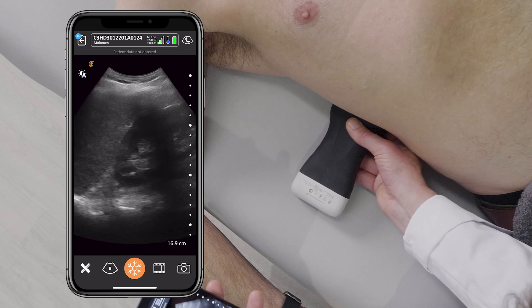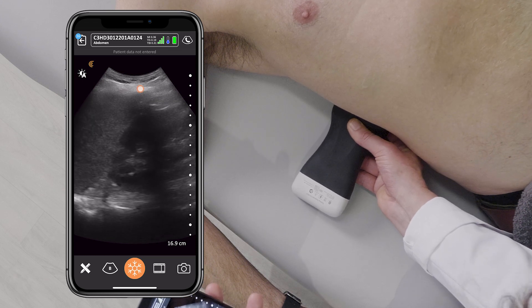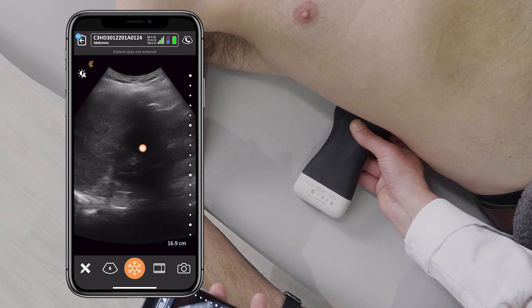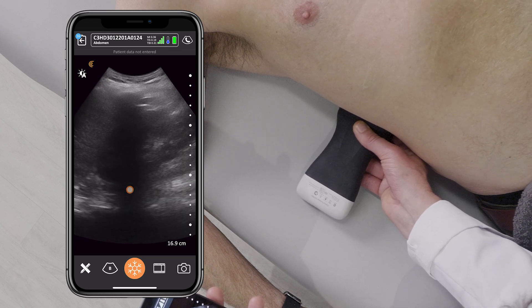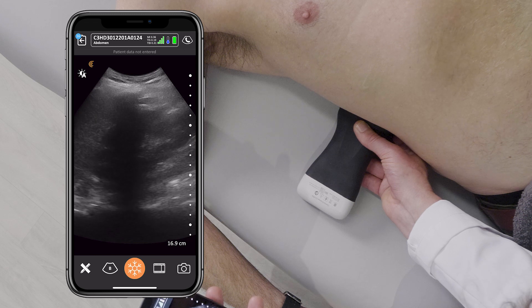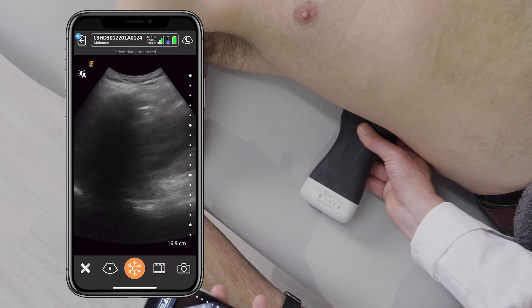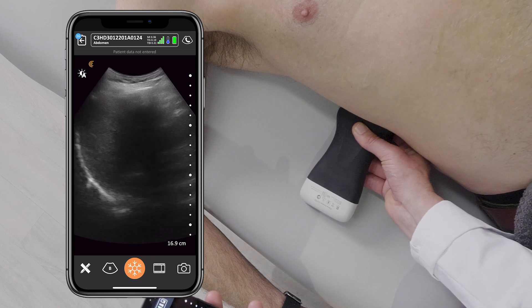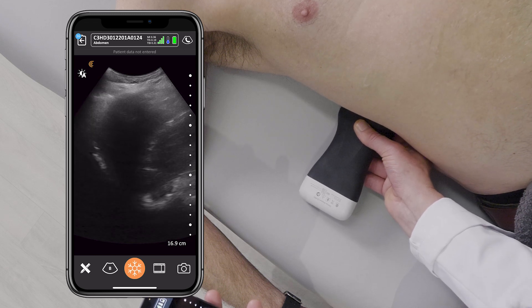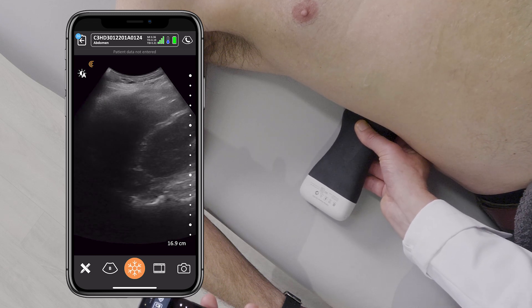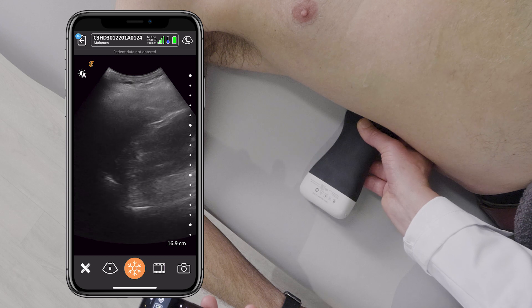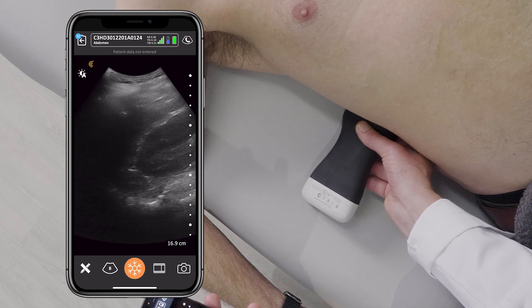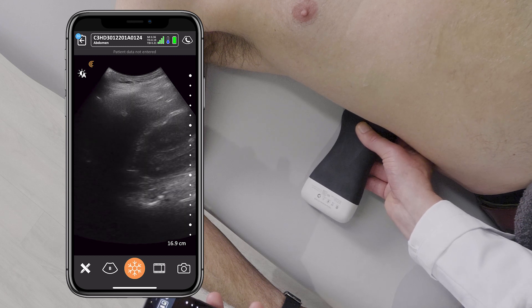If I'm having trouble seeing the kidney because of a rib shadow, I can ask the patient to take a small breath, and this can bring the kidney right onto my probe. Breathe out.